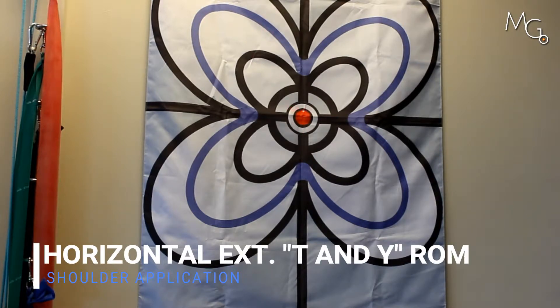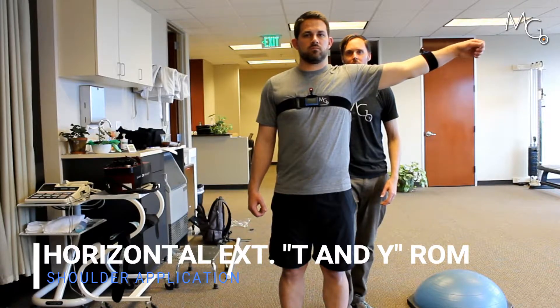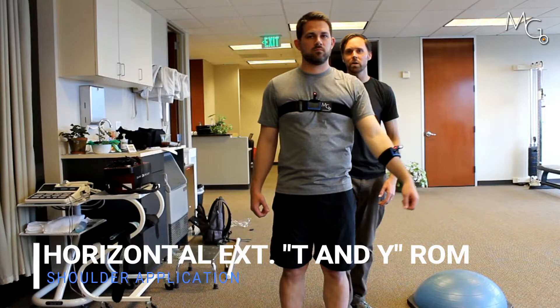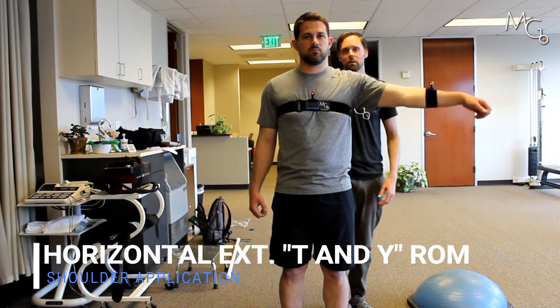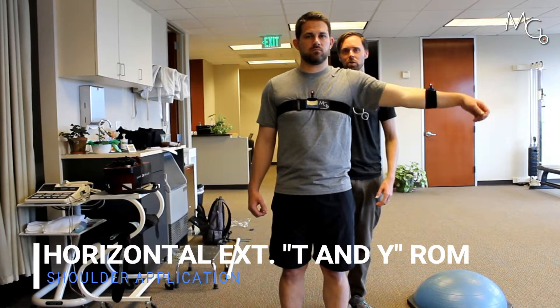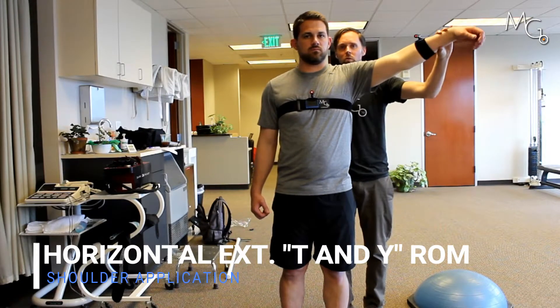Good. Back down. Good. Now move your arm even a little further so you can project the laser beyond the center target. There you go. And back down. So it's going to monitor how much Chris is rotating through the thoracic. That's a pretty cool additional cue for your patient.